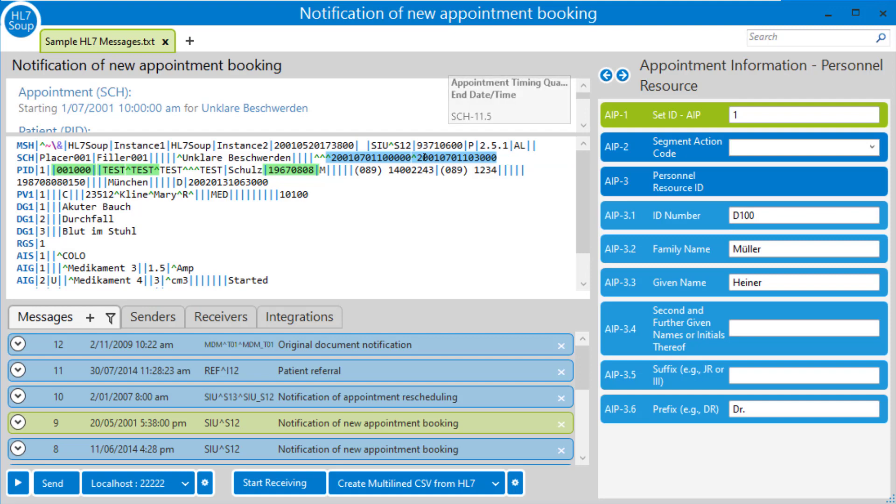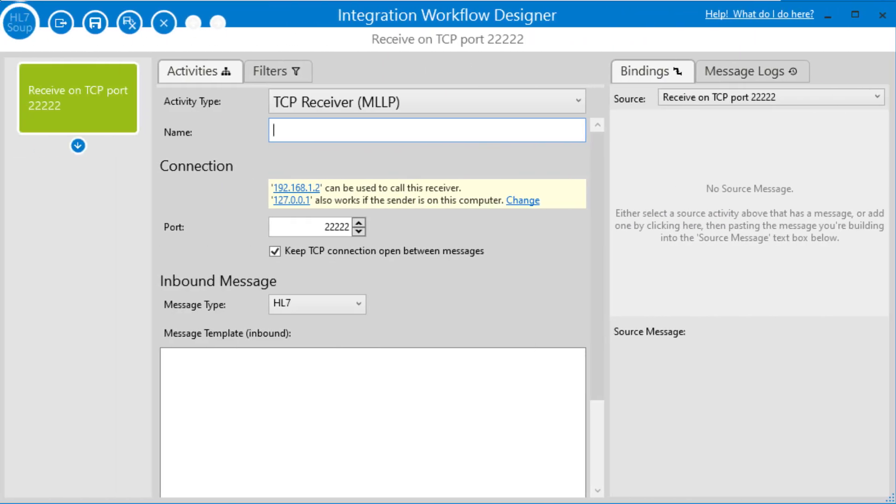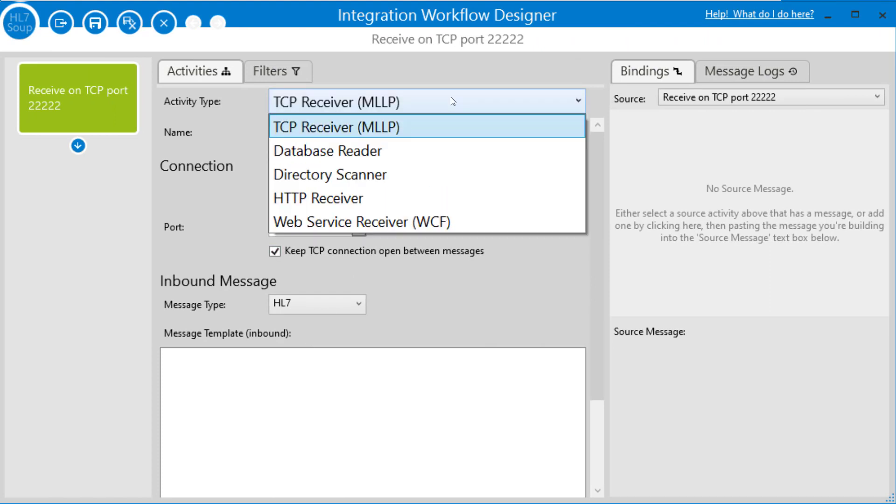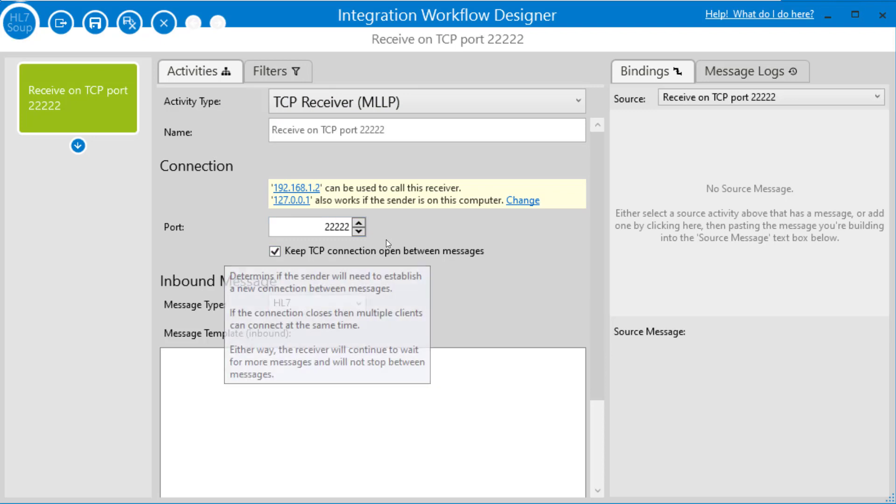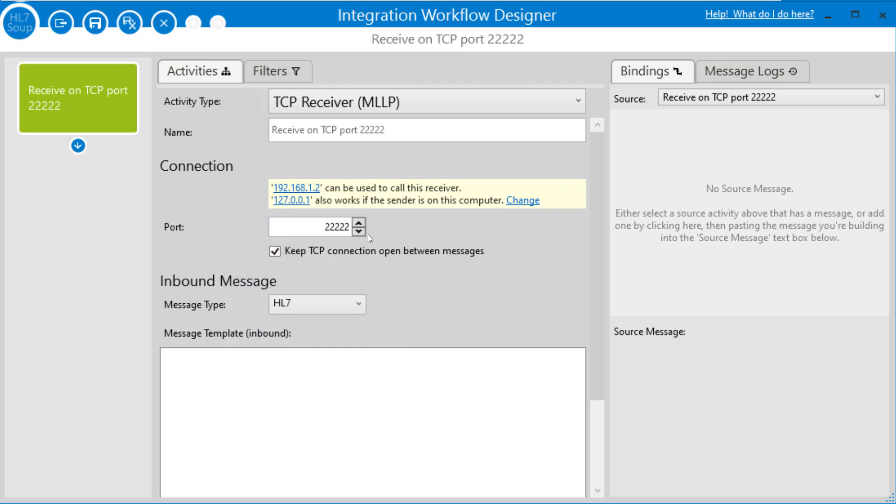So let's head over to the integration host and create our workflow. So here we are on the integration workflow designer. We're going to receive our messages by TCP, but I've got some choices. I could get it from the directory scanner or HTTP receiver. There are other options as well. So I'm just going to take the defaults. It's going to come in on port 22222 to my local machine, and the message type will be an HL7 message that we're going to be receiving.